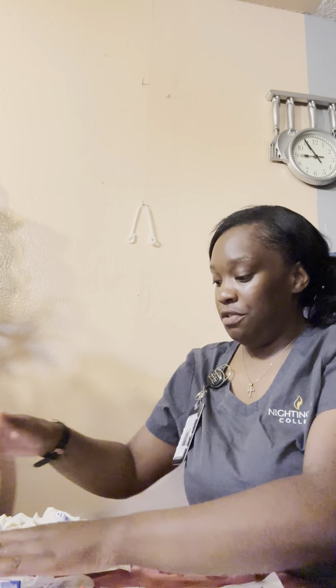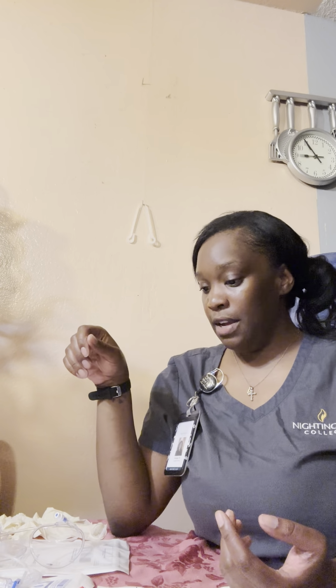All right, so now that I have verified the orders, I'm also going to check the 6 rights of medication, which is the right patient, right medication, right dose, right route, right time, and right documentation. So that's when I'll gather all of my supplies and I'll knock on the patient's door, close it for privacy. I'll introduce myself. I will also ask the patient their name and date of birth to get the verification, and I'll check their wristband to get that second step of verification.